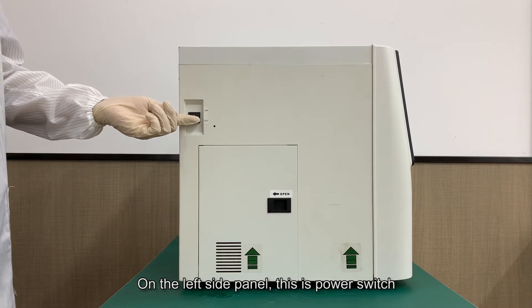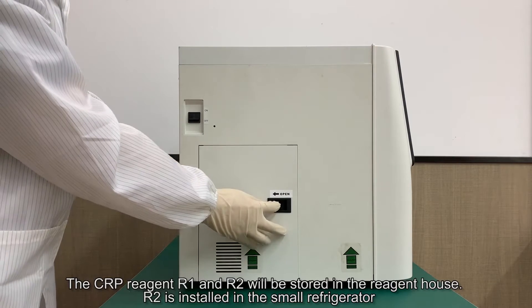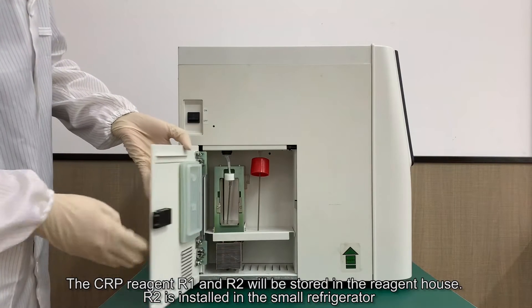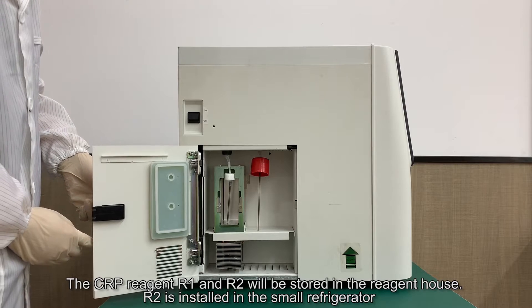On the left side panel, this is the power switch. The CRP reagent R1 and R2 will be stored in the reagent house. R2 is installed in the small refrigerator.